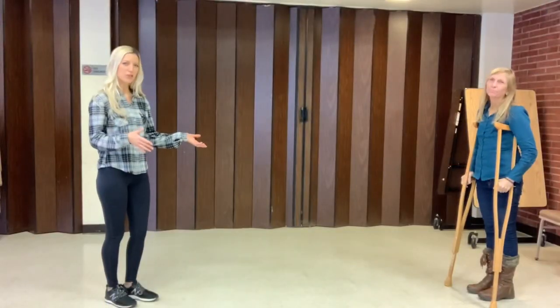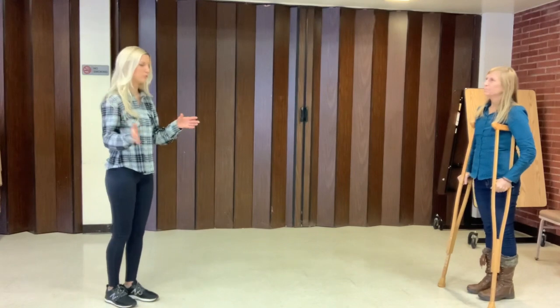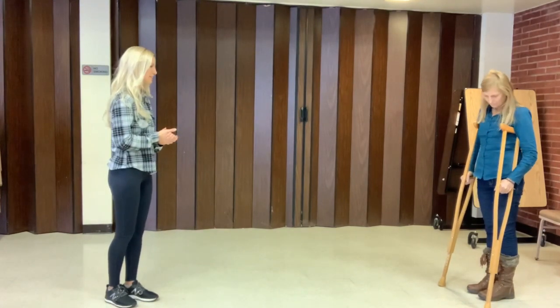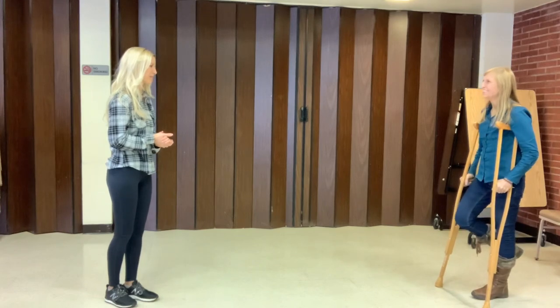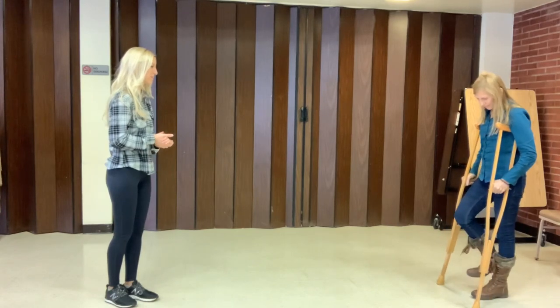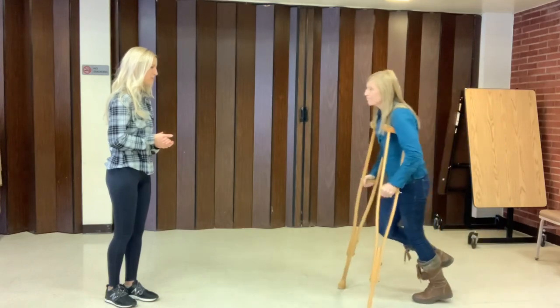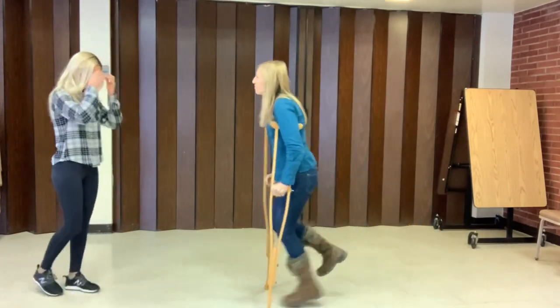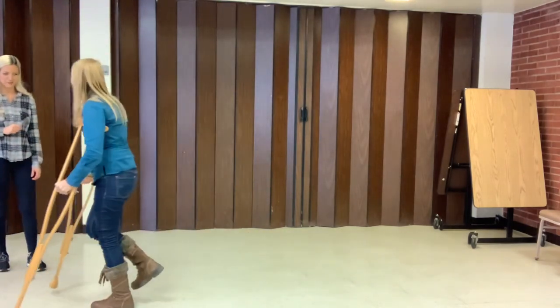Okay, so this is my mom. She's never used crutches before, so we'll see if she can do it based on my demo. All right, so let's do this. Yep, bad leg up, crutches ahead of you. Lean forward and swing through, yep. Keep my head up. Yep, look straight ahead.